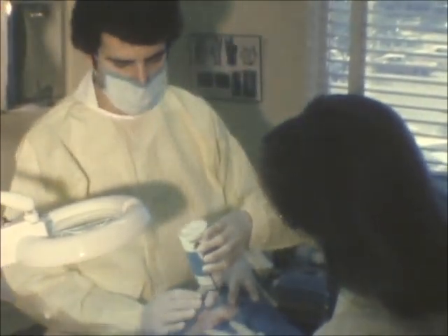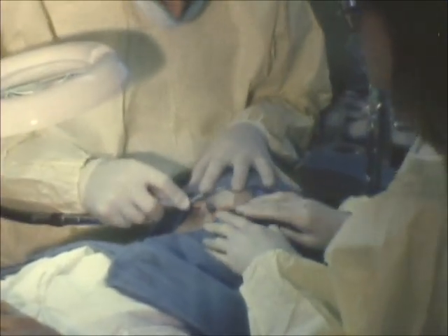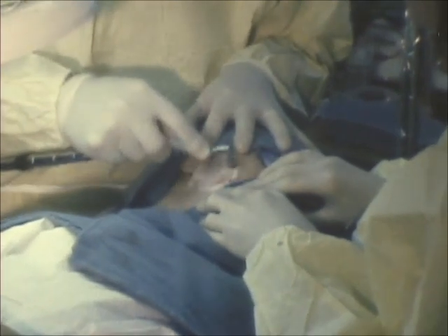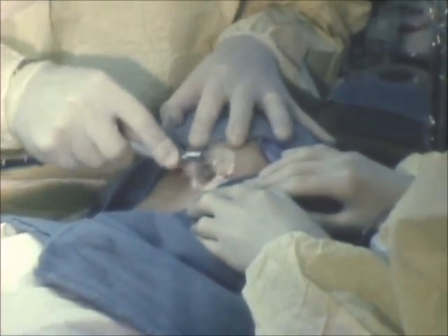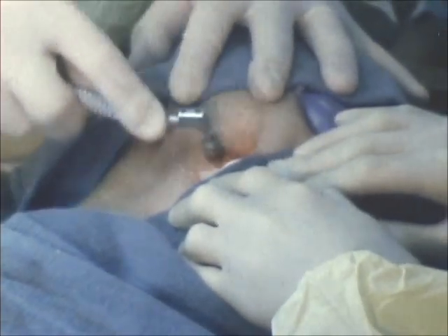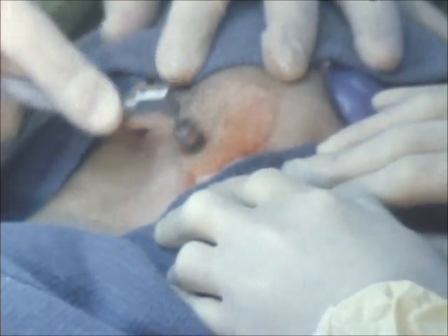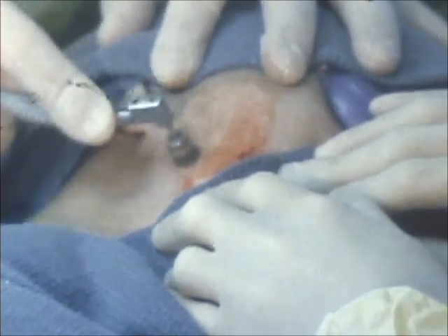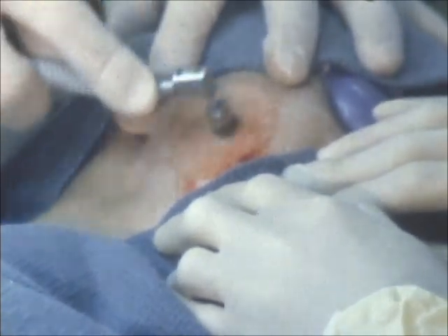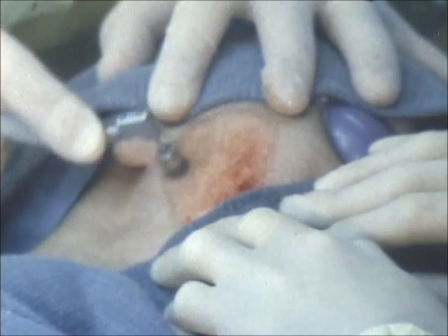In this case we're just doing a superficial abrasion, so the cutting is not that deep. At the jawline where we're at now, we must keep it light because there are certain nerves close to the skin. If you freeze too deeply, you can injure the nerve. Also, if you freeze too deeply, the skin is quite thin here and you can cut into the skin easily. This is the area of a slight blending, so we use a light abrasion. Now we're getting into the deeper areas and we can use a deeper freeze.